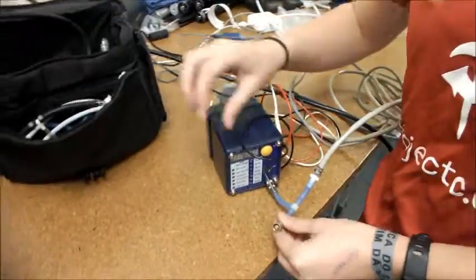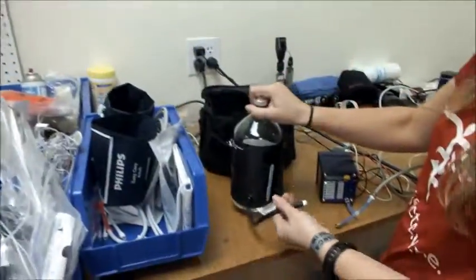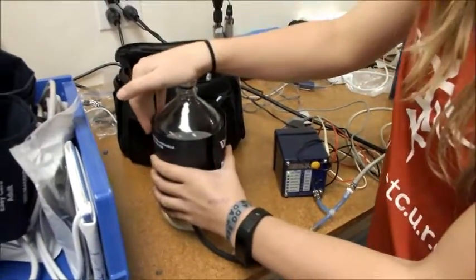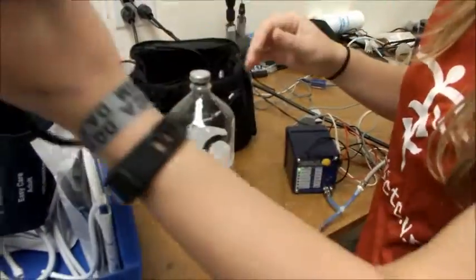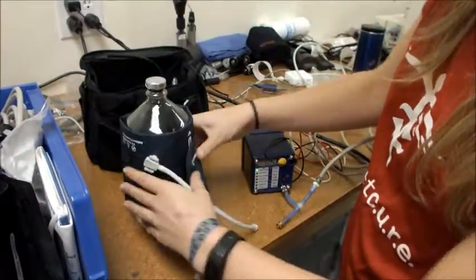Finally, we're going to connect this end to a blood pressure cuff, which we will place around this bottle. If the connection on the bottle doesn't work, simply remove the cuff and replace it with the correct connection onto the bottle.